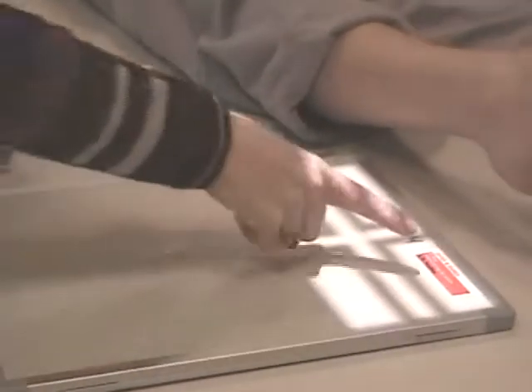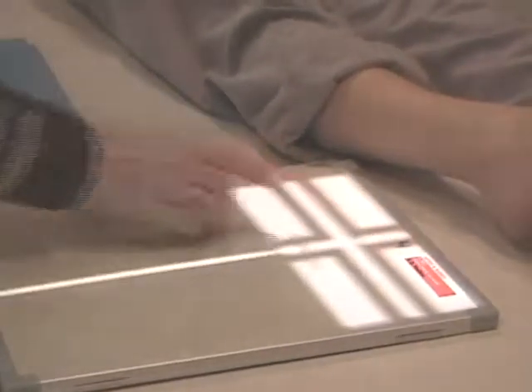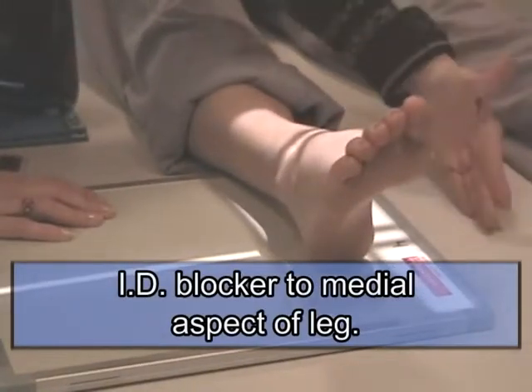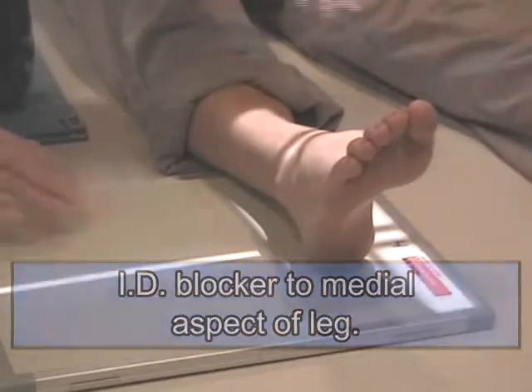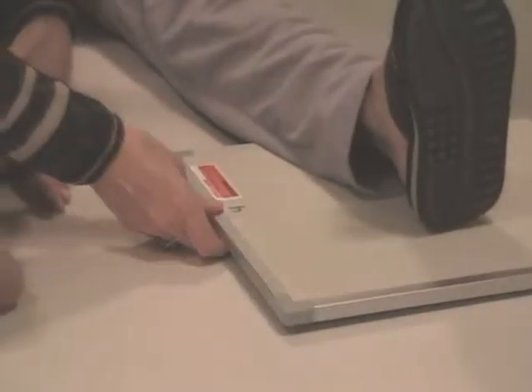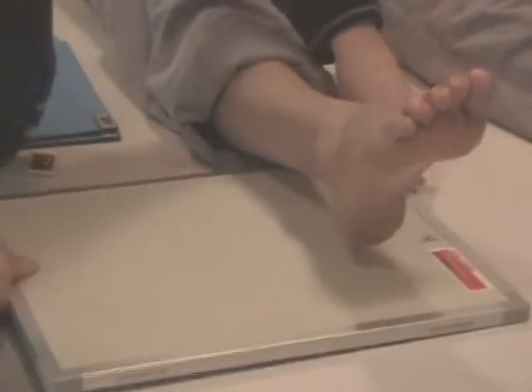and the 14 by 17 cassette is going to be placed with the ID blocker to the medial aspect of her leg. If it was a left leg, the cassette would be reversed, and the ID blocker would be to the medial aspect of her leg. But her right leg, here, this is our setup. Okay. Divide your cassette into equal thirds.